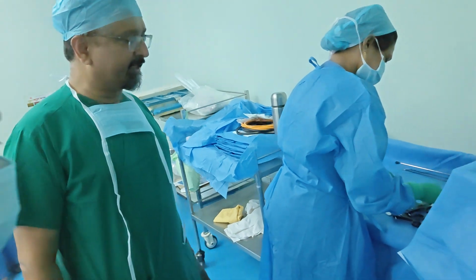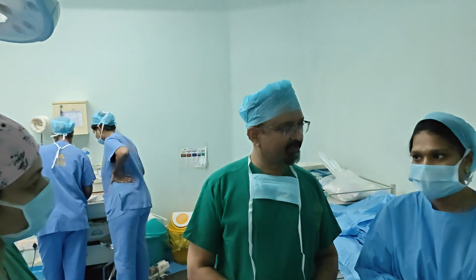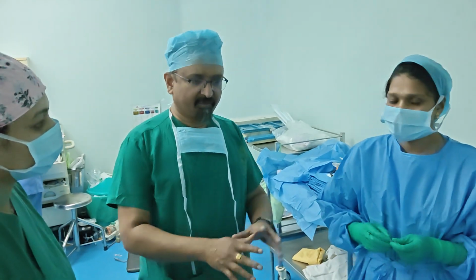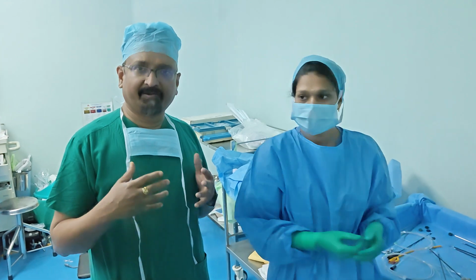Now what else do we need at the end of the procedure or the beginning of the procedure? We need to empty the bladder, right? So we can either use a feeding tube or what can we use? Silicone catheter, Foley catheter. So in a baby you use either a 6 French or 8 French catheter. So we have to arrange all these things, and only then are you very well prepared.